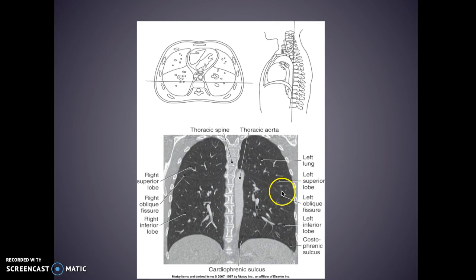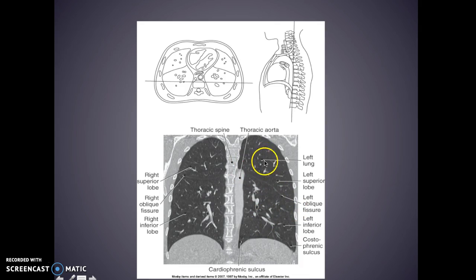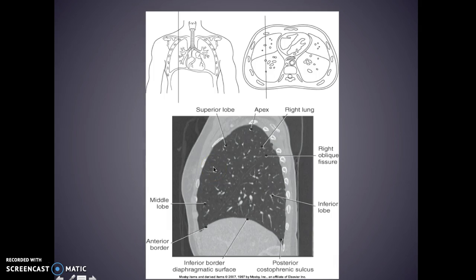This is a CT high-resolution chest. This is the T-spine, this is your thoracic aorta, here's your left lung. We see the fissures really well — here's your left oblique fissure, this is your superior lobe and your inferior lobe with your costophrenic angle and your cardiophrenic angle. Here's your right inferior lobe, you can see the right oblique fissure right there, and here's your superior lobe. This is a high-res CT reformatted into the sagittal plane — we have your right oblique fissure right there.